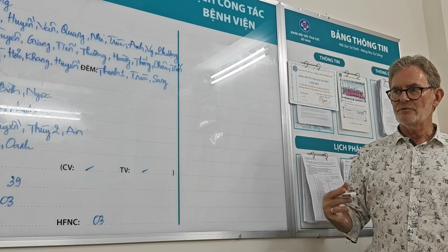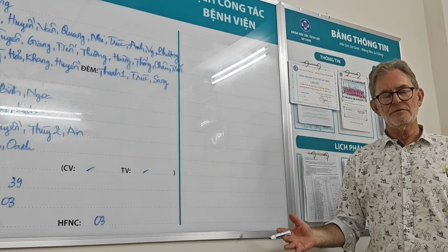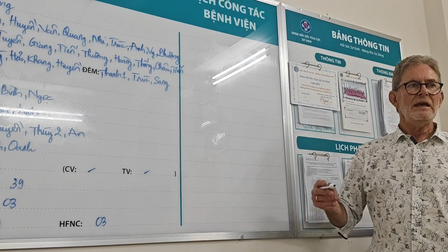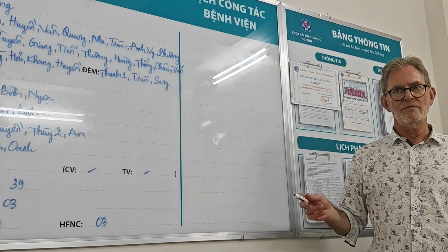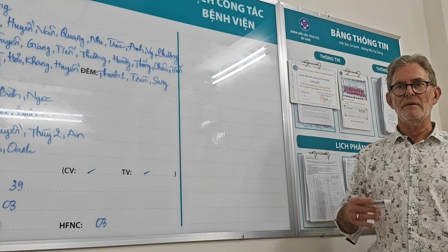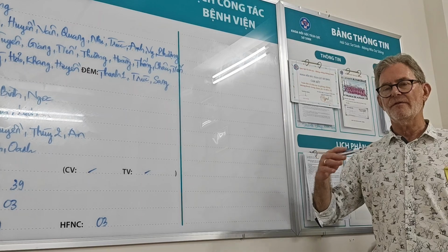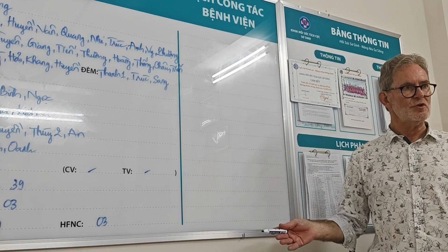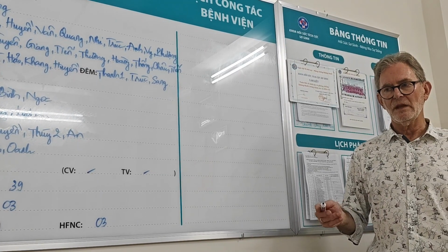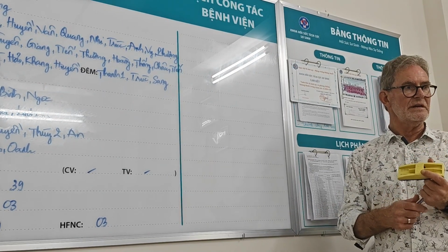The problem with conventional mechanical ventilation is as you start to push the rates up, so you're having CO2 problems, you think maybe I'll fix it by going to a rate of 70, rate of 75, the conventional ventilators become mechanically inefficient at that time, and you get into problems where you can't achieve full emptying of the lung in the very short expiratory times you need when you're trying to use higher rates. So generally I wouldn't go over a rate of 60.